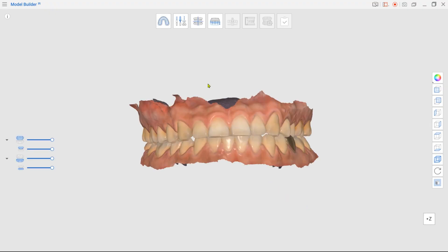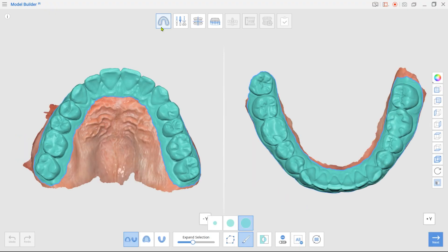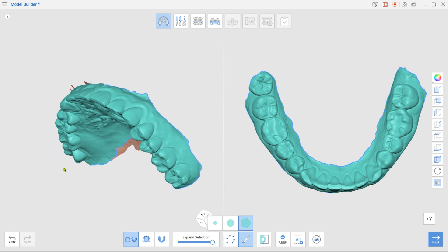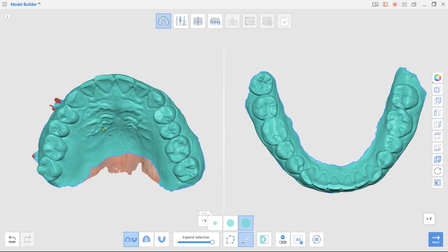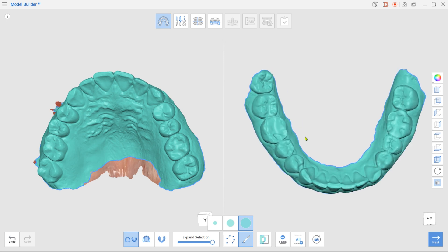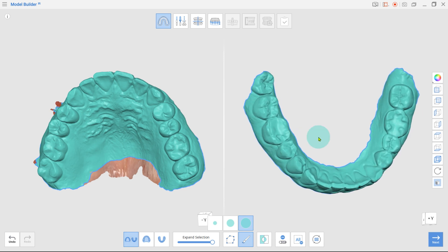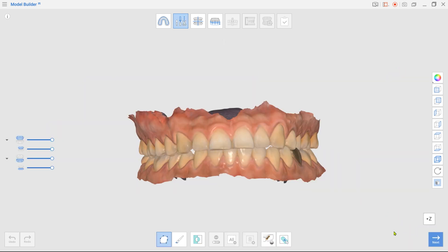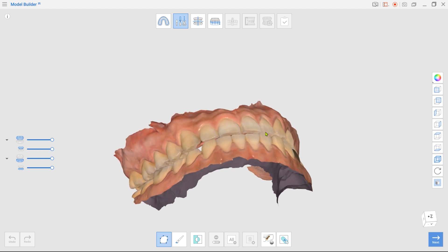Enter Area Designation mode. Enlarge selected areas using the Expand Selection slider. Left-out parts can be selected with brush selection. Click Next to enter Edit mode, where you can trim the scan data or fill in holes.